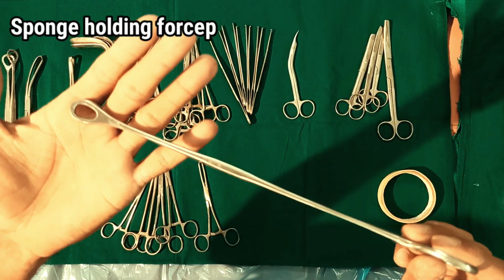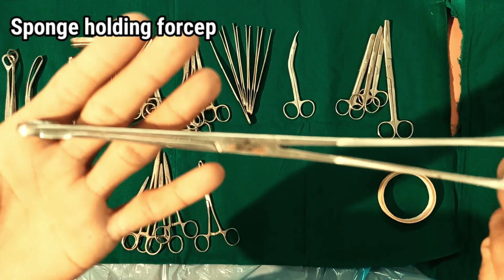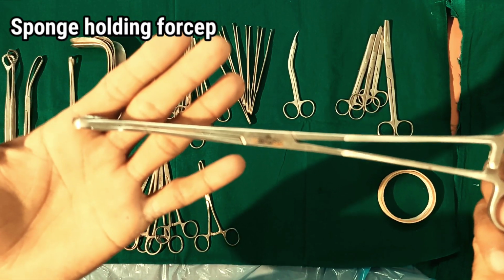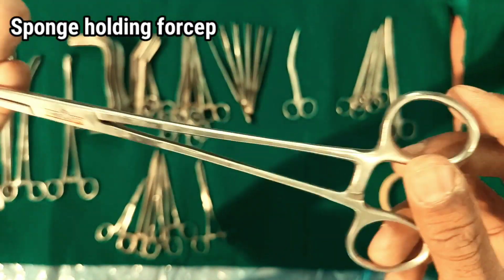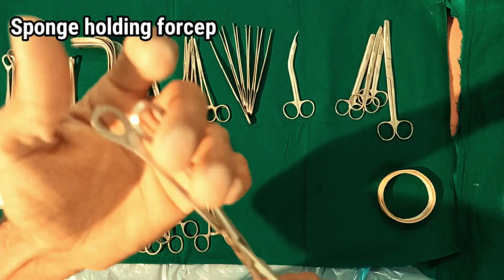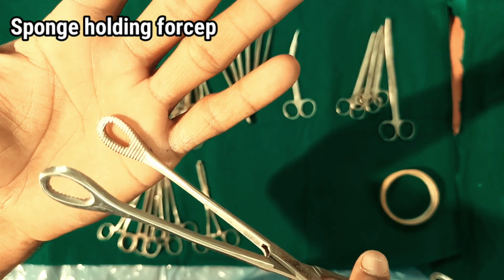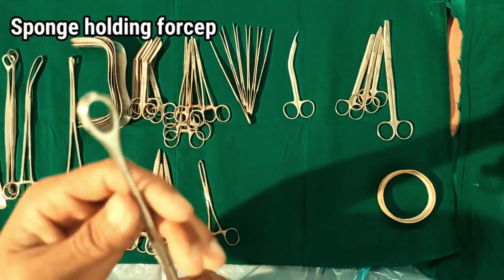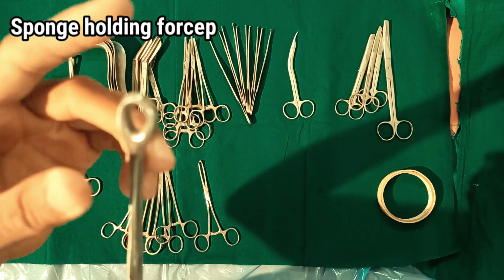Sponge holding forceps. A sponge holding forceps or a sponge forceps, as they may be called, are instruments which are used by doctors to hold on to sponges and or swabs while conducting their medical procedures. Sponge holding forceps are usually made in the shape of scissors. The jaw of this forceps can either be serrated or they may be smooth.